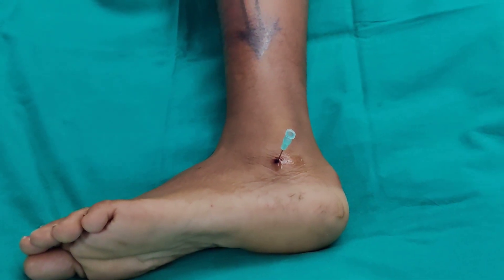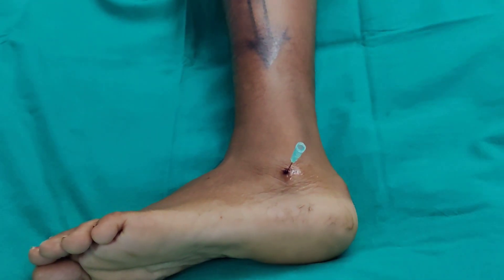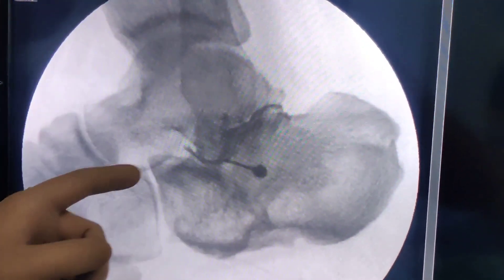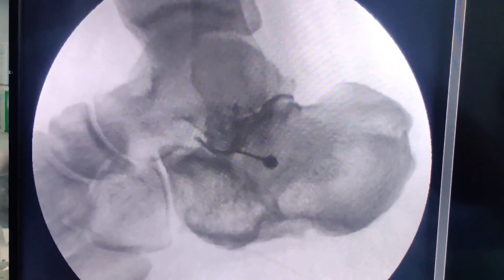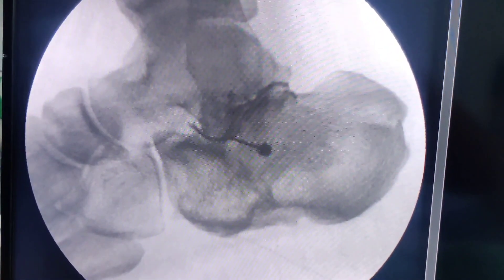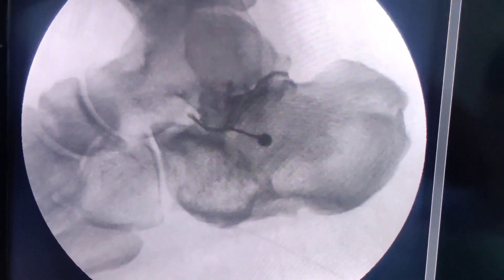My next step is to inject some Omnipaque to confirm I am in the right spot — just a little bit, and then we will take some X-rays. It is always advisable to use Omnipaque, take these images, save them, and put them in the patient notes, especially in this era where everything has become medico-legal. If you see a nice flow in the front and a nice flow in the back, that confirms the position of the needle in the subtalar joint.